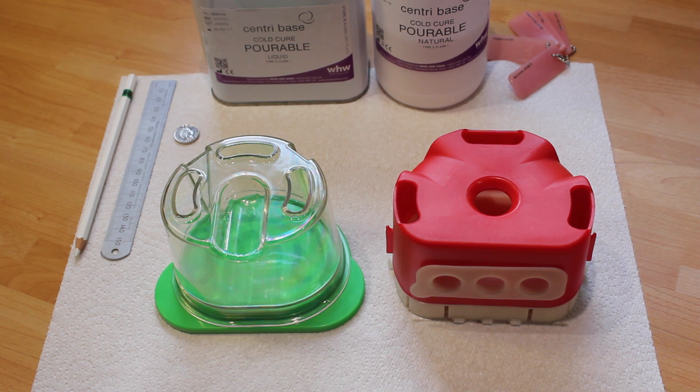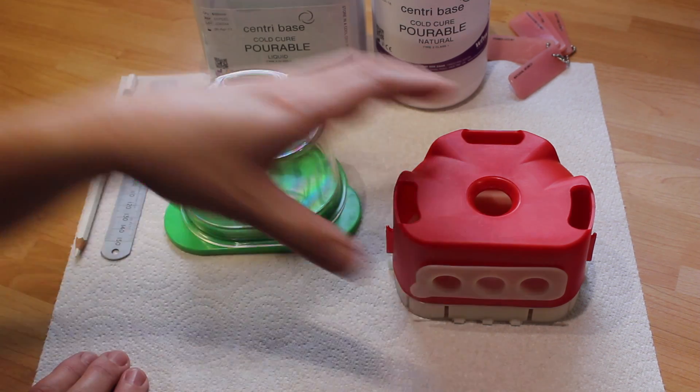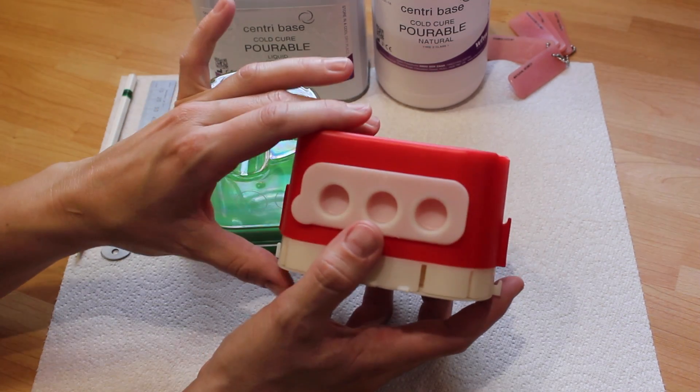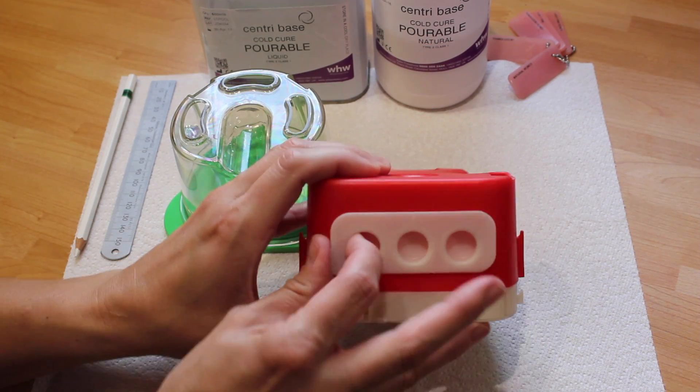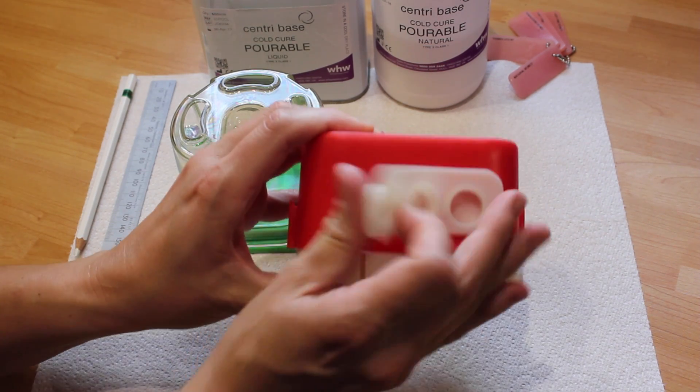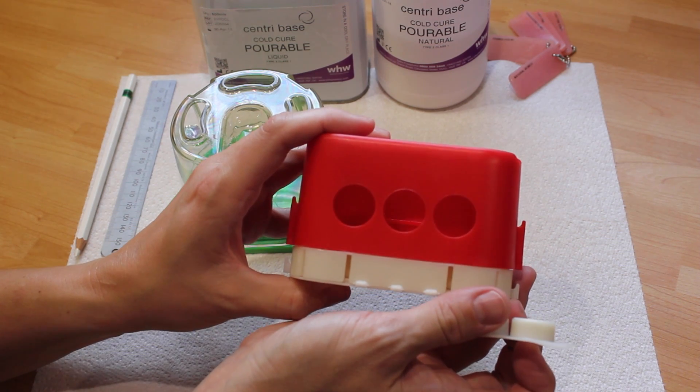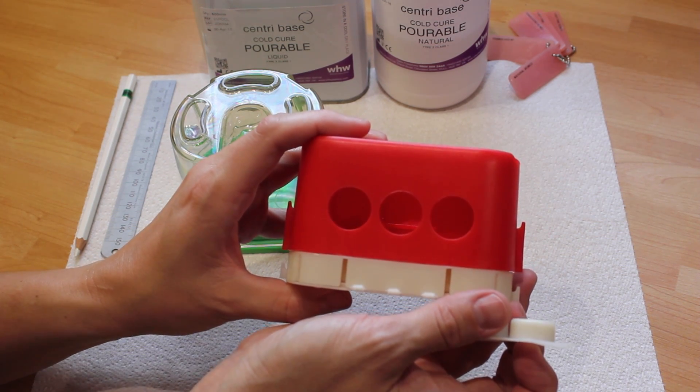Welcome to this WHW video of flask customization for pourable acrylic. You can purchase a custom-made flask like this one which is just like a standard duplicating flask but with the addition of three holes in the back to allow access to your pour channels.